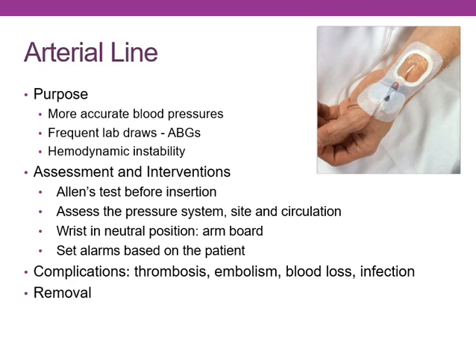So I expect to have all those, and you should look at all of those every 2 hours with somebody with an arterial line. Now, if you have somebody, this looks like a left arterial line, their right radial pulse is 3+, and their left with this arterial line is slightly less, 2+. Would you be terribly concerned? No, because they have a line in it. If it's slightly less, I'm not concerned. But if their right is 3+ and their left is 1+, I'm concerned. And is this pale, cool, and I've got a poor cap refill? If so, I've got a problem with the arterial line.